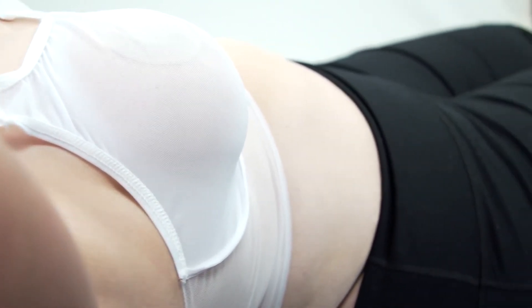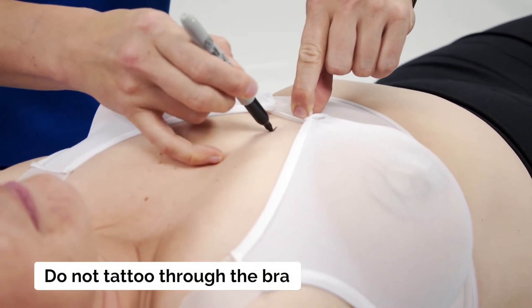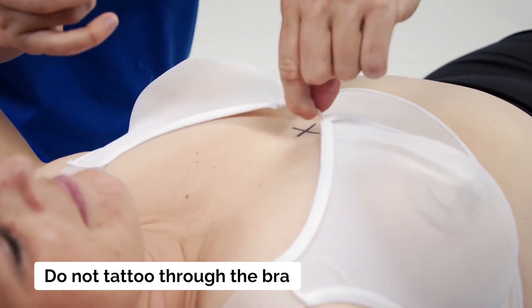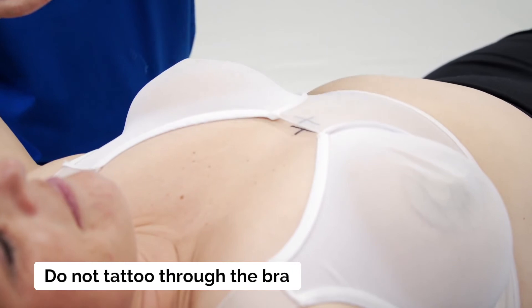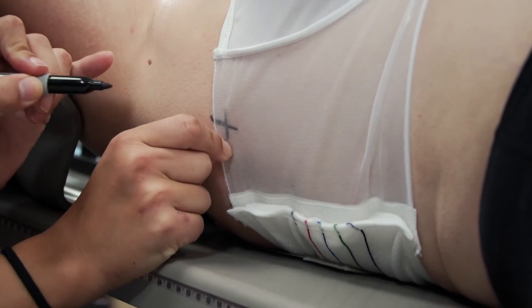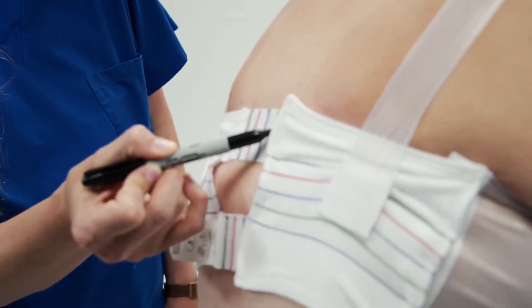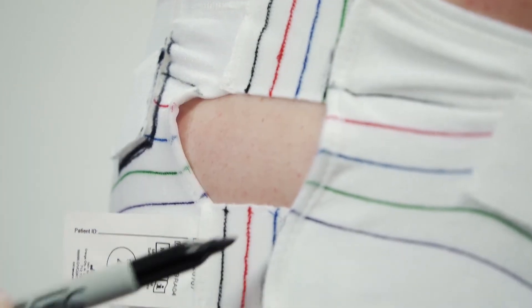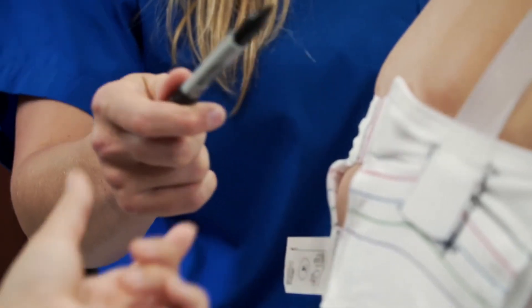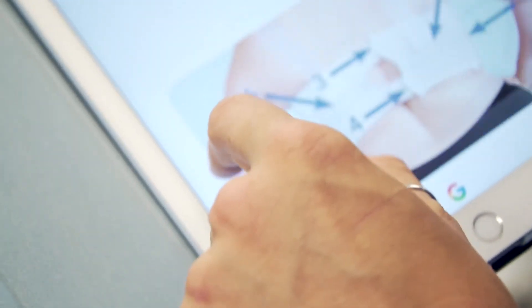Once the bra adjustments are complete, mark the bra using a permanent marker. To make marks under the bra, lift the bra above or below laterally. Mark the skin and then ink-stamp the bra in the desired area. Once you remove the bra, you may tattoo your patient where the mark is. These marks may be used in conjunction with the colored indexing seams. Marking the bra is highly recommended for better reproducibility. Mark the areola, nipple, or any of the patient's other distinguishing characteristics in the corresponding area of the bra. Now you can record all bra indexing and any additional notes on the Chabner XRT radiation bra setup sheet.